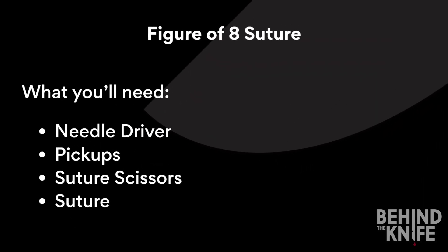Today we are going to learn how to perform a figure of eight suture. For this you will need a needle driver, pickups, suture scissors, suture, and your behind the knife suturing board.